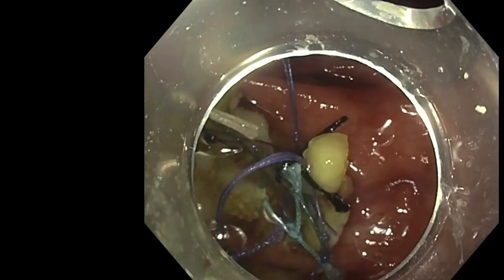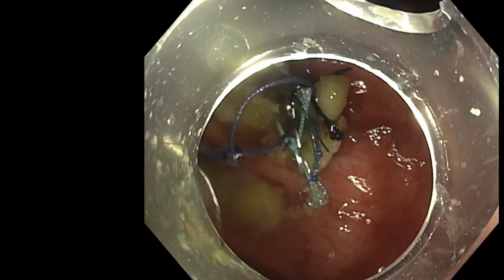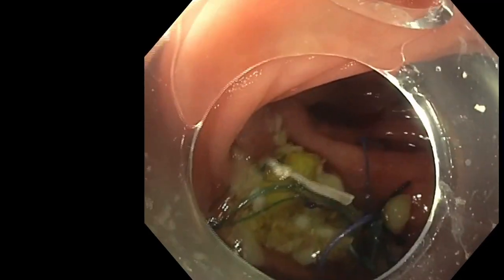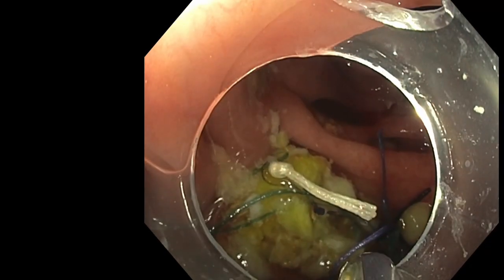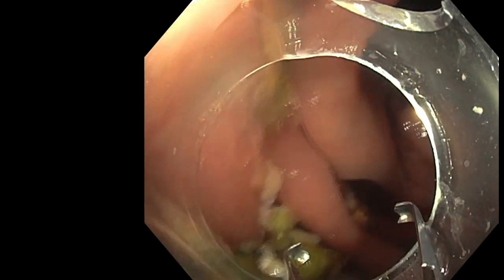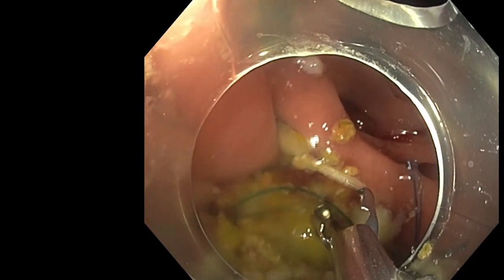We use mostly Boston clips because for this purpose it's better to have a clip that is rotatable by the physician. It's a little easier to control the rotation by yourself than having a perfect coordination with the nurse, but if you have a very good coordination with your nurse, it is possible to use other clips, but I like to turn by myself because it's sometimes challenging to catch the loop.